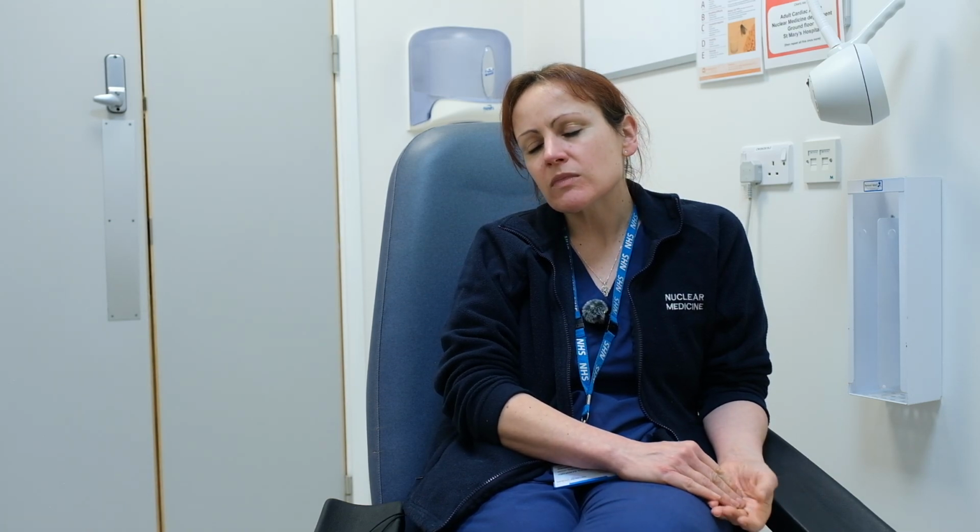So the three-phase bone scan we tend to do on patients if we're specifically looking at joints. So this could be like if the clinician's querying whether it's an infected prosthesis or whether it's rheumatoid arthritis or inflammation of the joints. The start of the procedure would be the same. We'd still check the clinical indication was relevant. We'd still ID the patient.